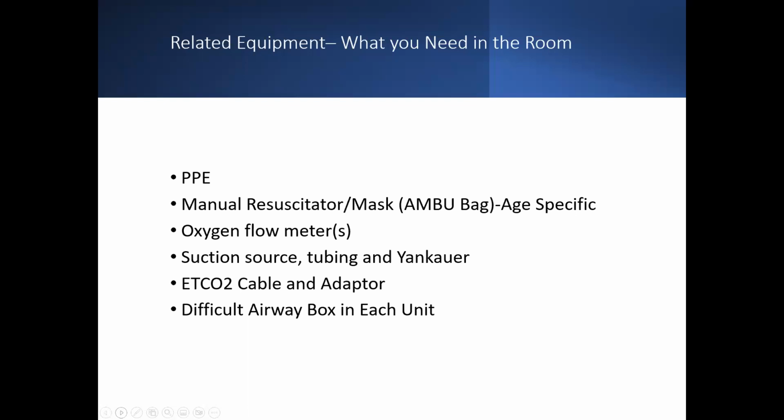In any case, suction source, tubing, Yankauer, etc. End-tidal CO2 cable and adapter. At a minimum, a colorimetric detection device. Difficult airway box, hopefully located in each unit. I will say difficult airway boxes are pretty much becoming the standard of care.